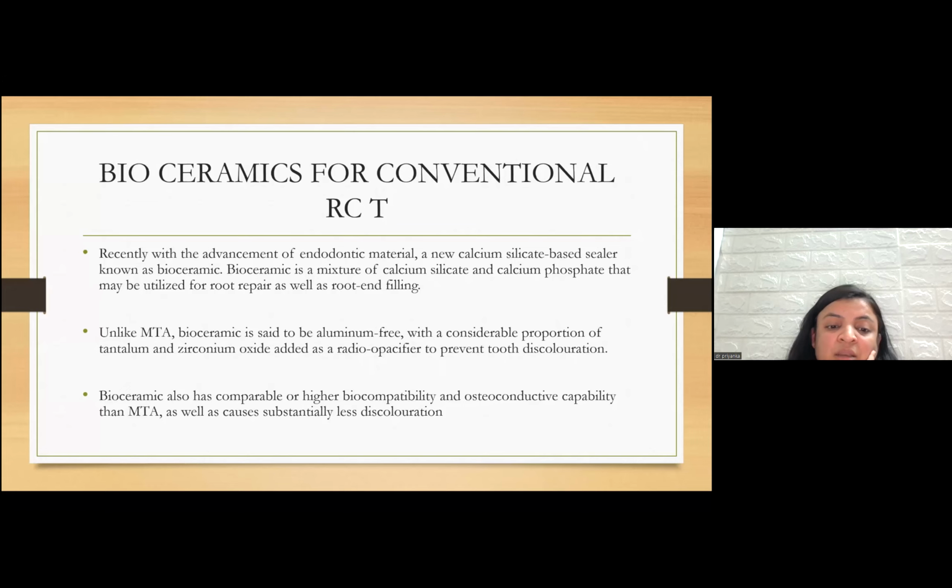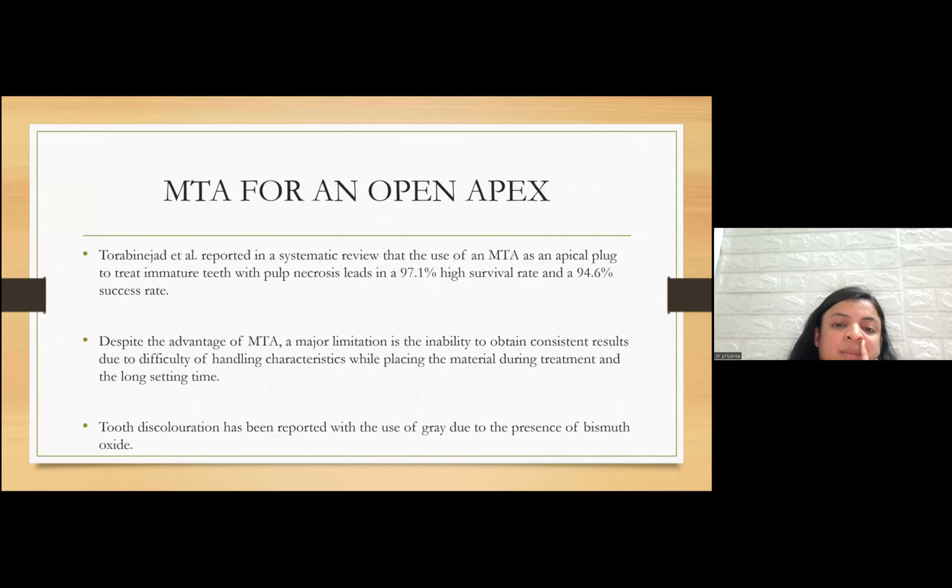Now, bioceramic also has comparable or higher biocompatibility and osteoconductivity than MTA, as well as it causes substantially less discoloration, the way I said. Now, MTA for an open apex.